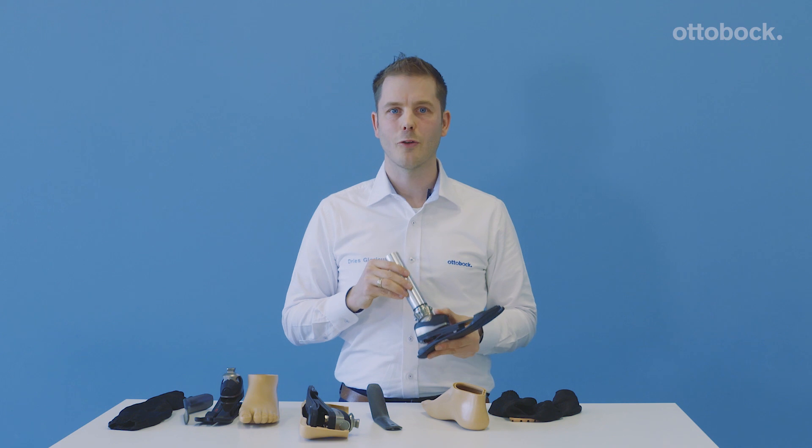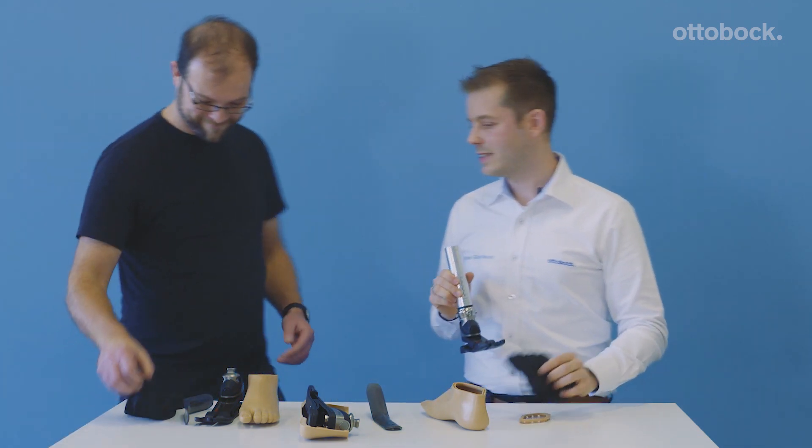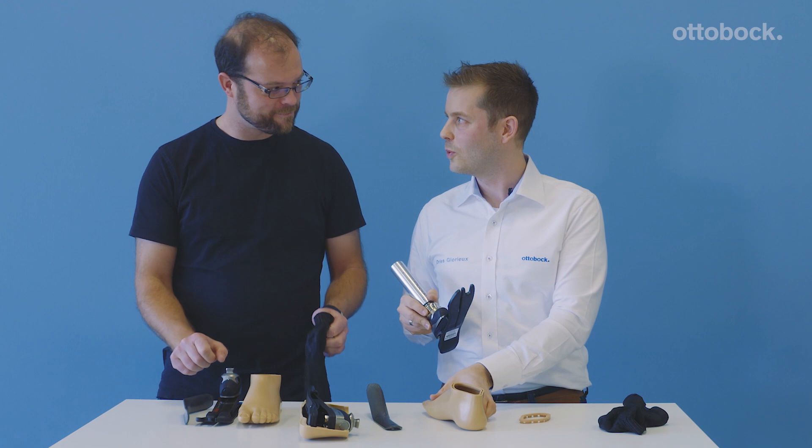I want to show you how easy it is — I've created some competition. I'd like to invite Miklas into the screen. So Miklas, let's see who's the fastest: the CPO or the engineer? Let's start. Three, two, one and start!